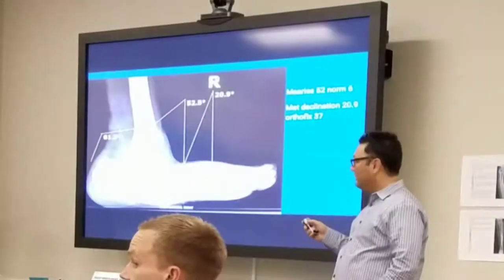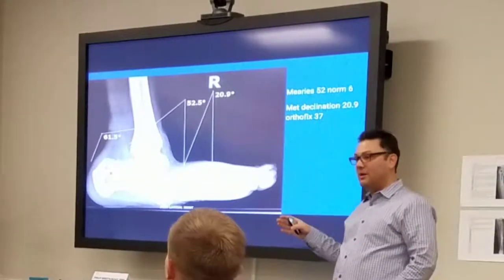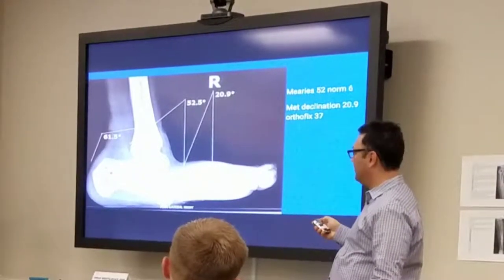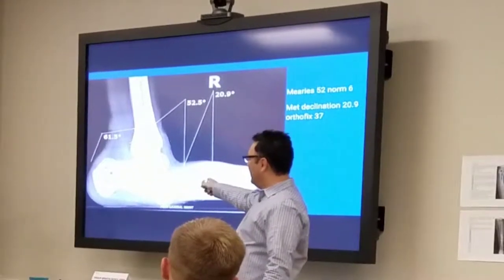So now let's talk about how to build this miter frame. I want to show you a step-by-step, because I think we're going to be getting into building a miter frame soon. I just want you to see on the picture so that you can kind of see. So here's that guy from way down before. You had that big deformity.